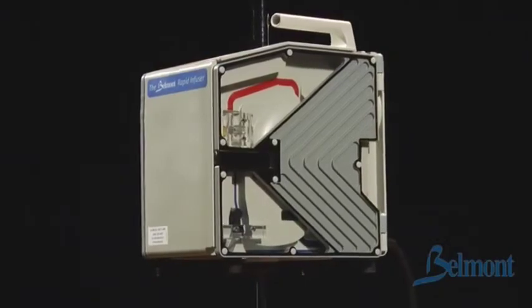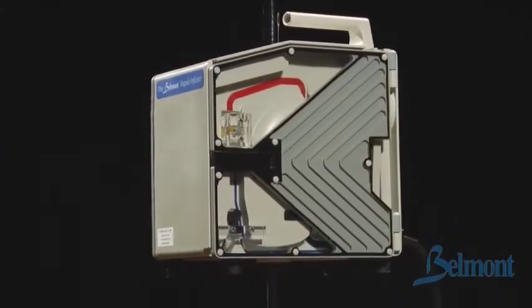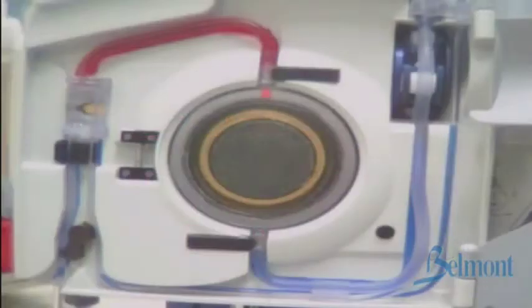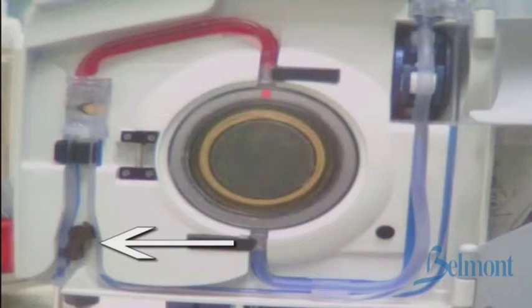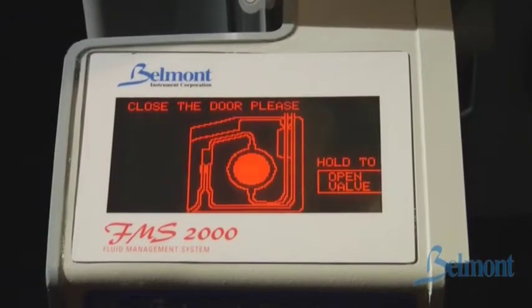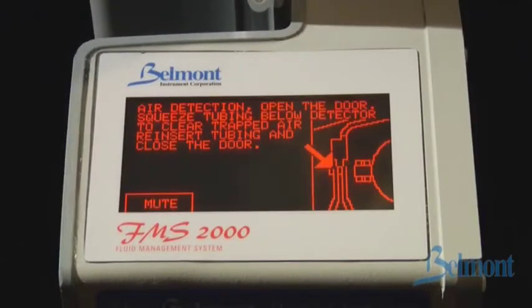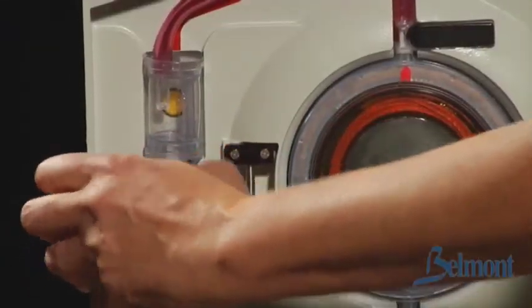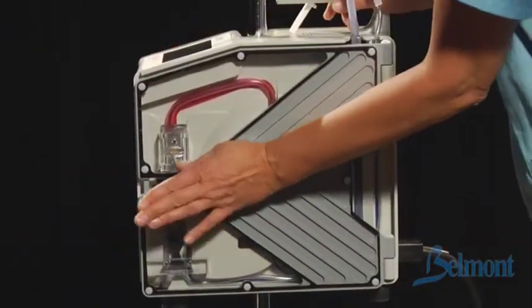The Belmont Rapid Infuser will sound an alarm if it senses a problem. In that case, it automatically stops pumping and heating, moves the patient safety valve into the recirculation position closing off the patient line, displays an alarm message, provides instructions for corrective measures, and sounds an audible alarm. To silence the alarm and return to normal operation, simply follow the instructions on the display screen.